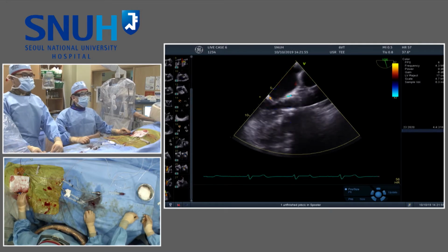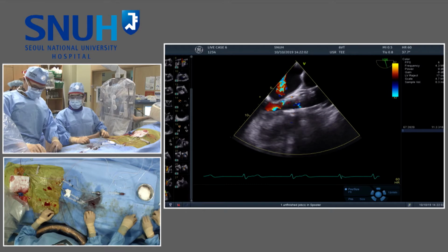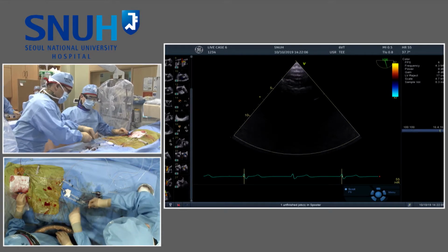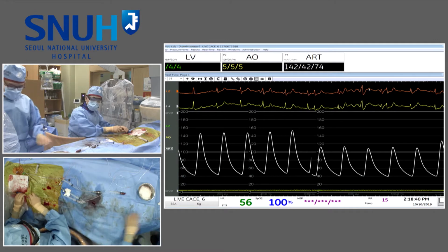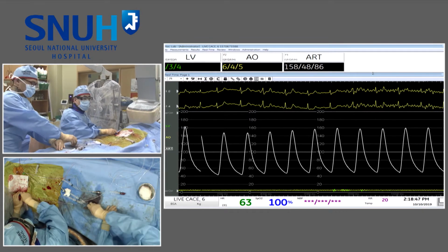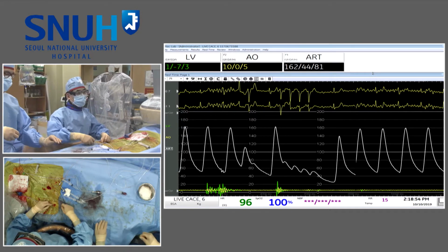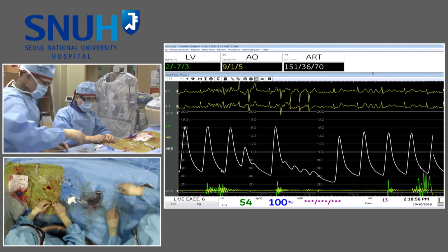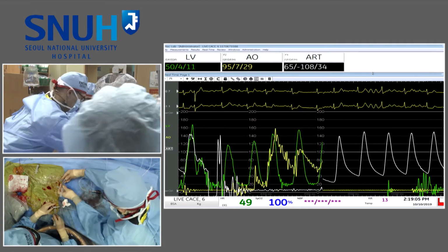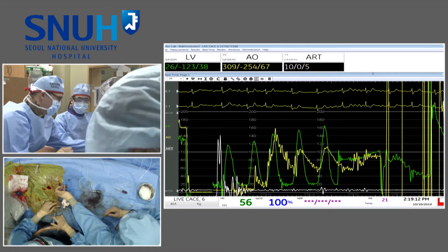Before removal of the stiff wire, we once again checked the valve frame in different angles and performed an angiogram. Oversizing is high enough, thus I changed the stiff wire into a pigtail catheter in the LV. Then perform angio. So, baseline. So you can see the TEE while we are manipulating.